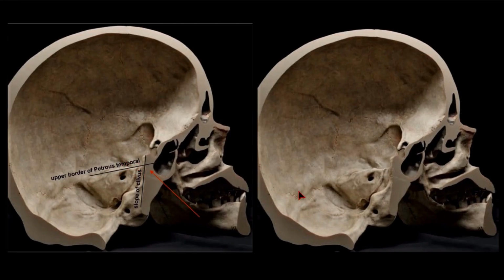So we can see here. So from both sides, you can understand the importance of the lateral view and the comparison between the real anatomy and the fluoroanatomy.